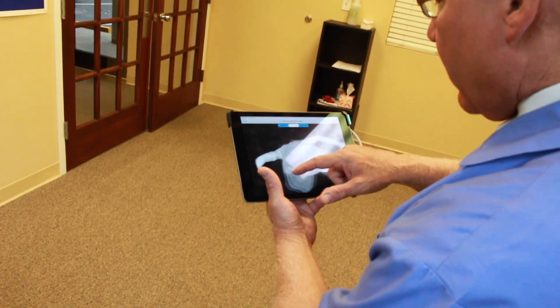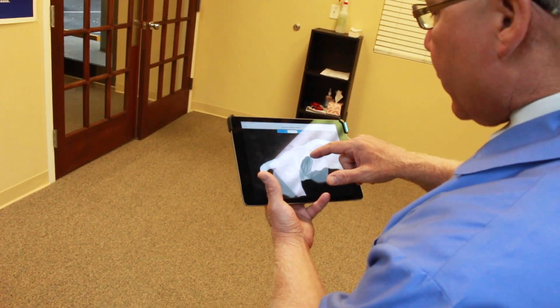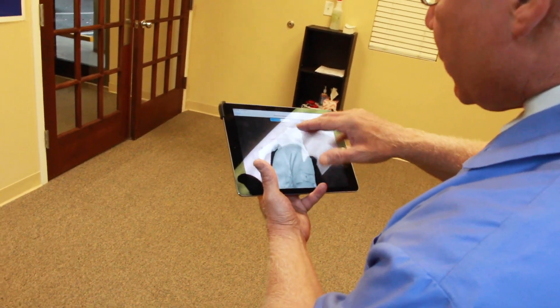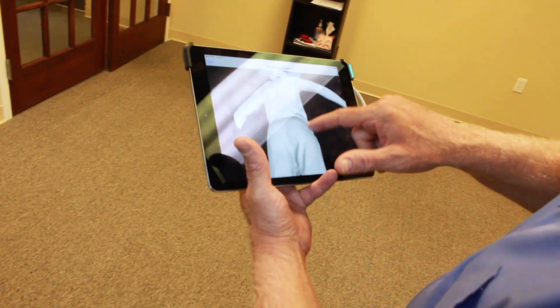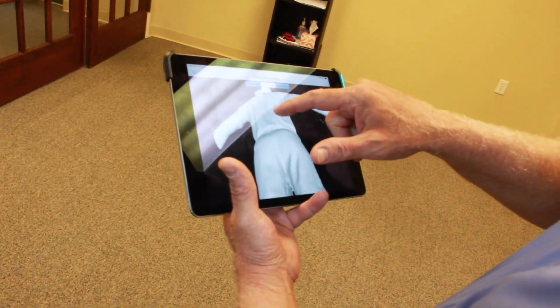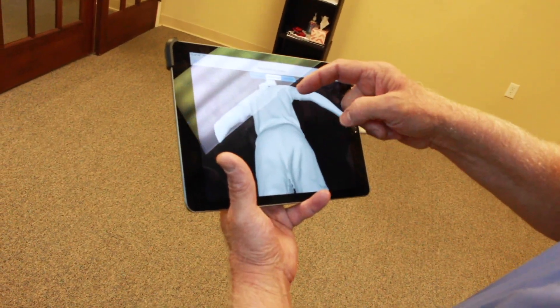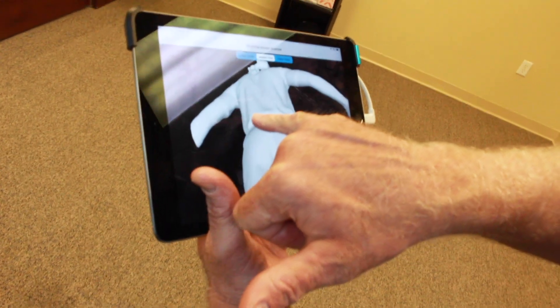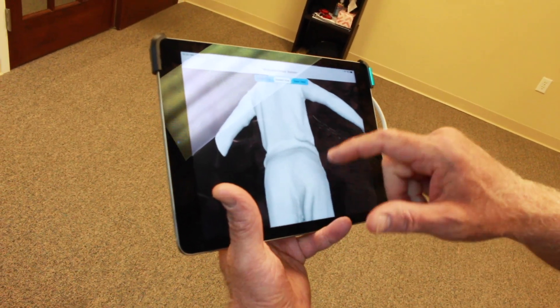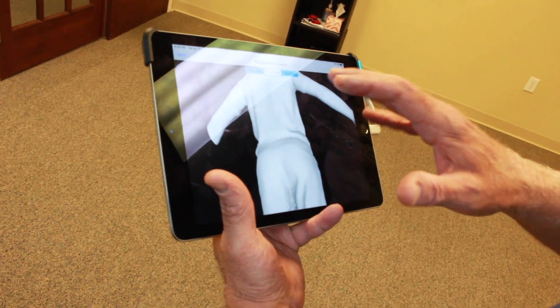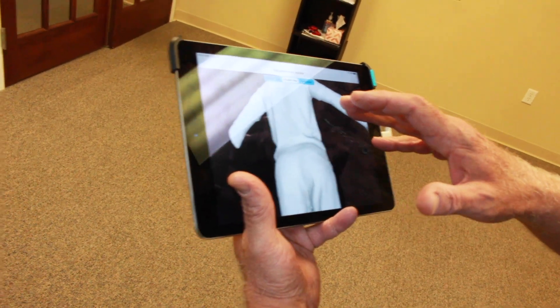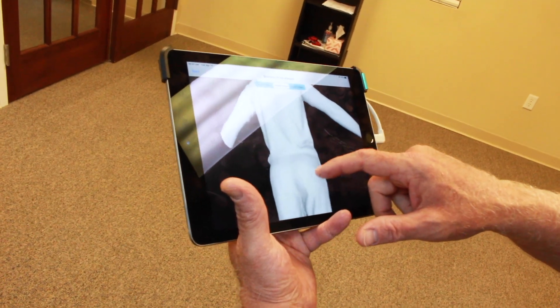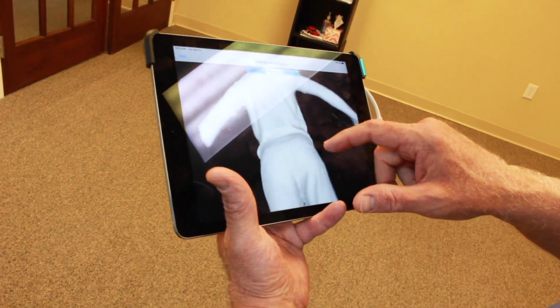With a scoliosis patient you may see a rib arch — the brace helps to reduce that. If they have a right thoracic curve, the brace is going to press here. With a left lumbar curve, it's going to press here. The brace scan helps to get that detailed information to make a really good-fitting corrective brace.